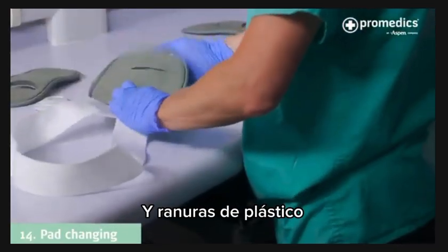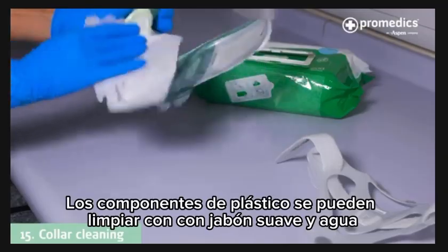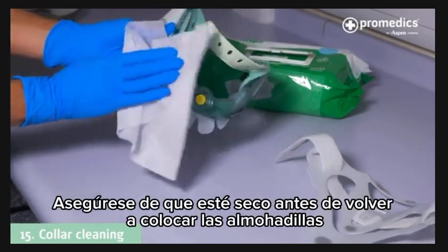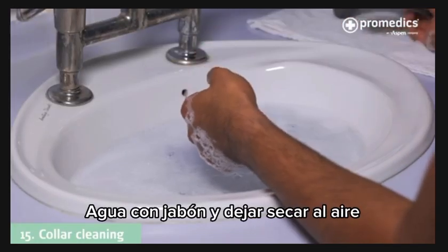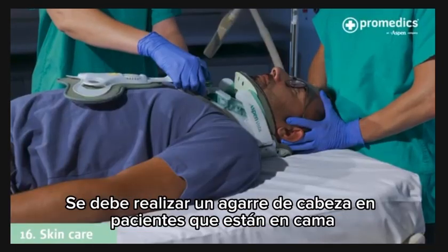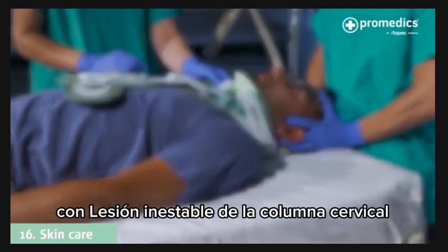The plastic components can be cleaned with either mild soap and water or a disinfectant wipe. Ensure it's dry before the pads are reattached. The pads can be hand washed in mild soapy water and left flat to air dry. Remove the collar at least once per shift. A head hold should be performed on patients that are bedbound with unstable cervical spine injury.